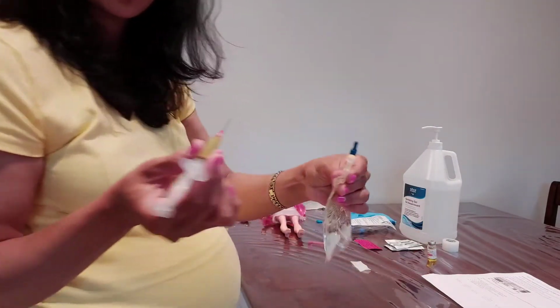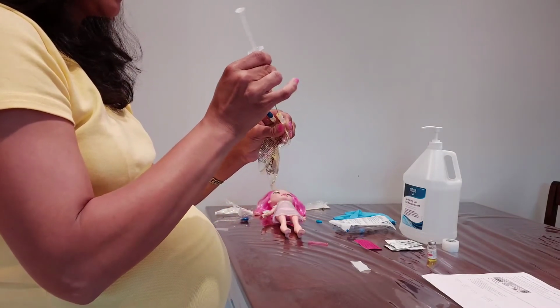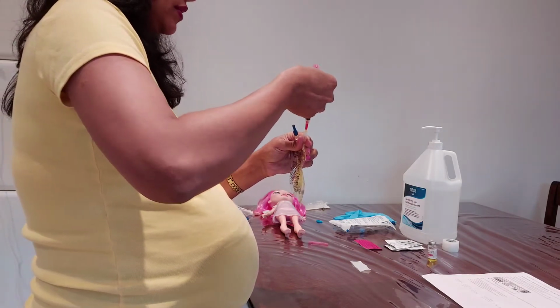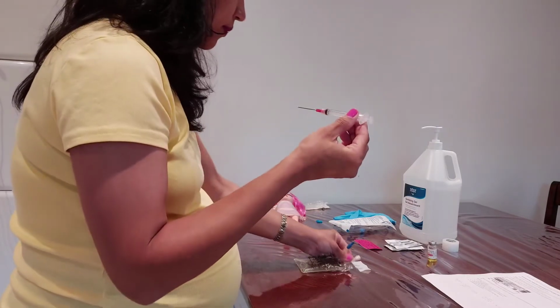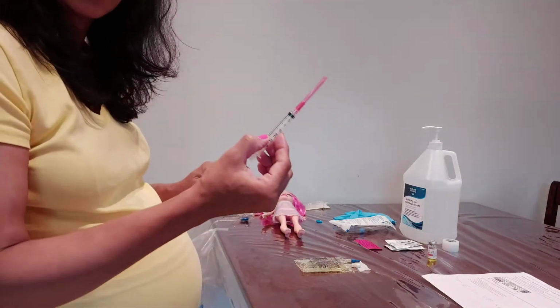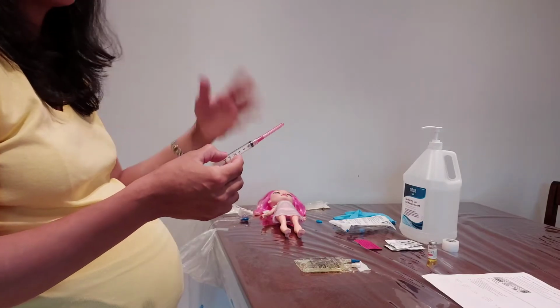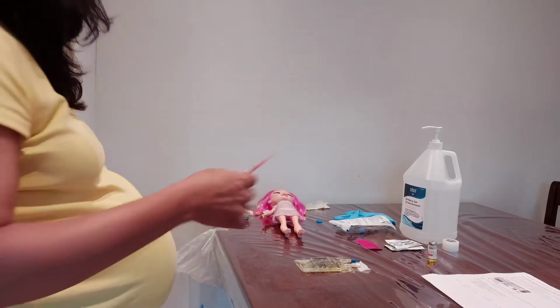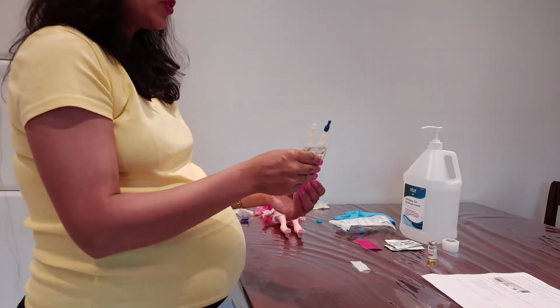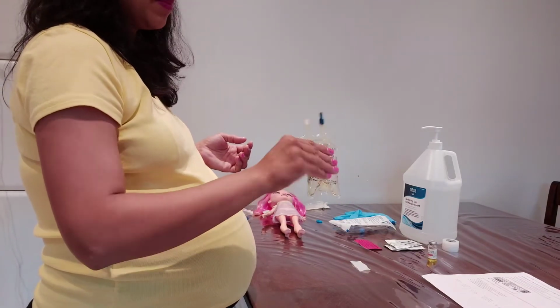I'm going to inject it into the mini bag that I already cleaned with the alcohol swab. I will put the medication in. I will recap it, and I have to put the syringe with needle into the sharps container without any cap, but for security I will put it in with the cap, and I consider it's a sharps container. So I have to just go back and forth with the mini bag.